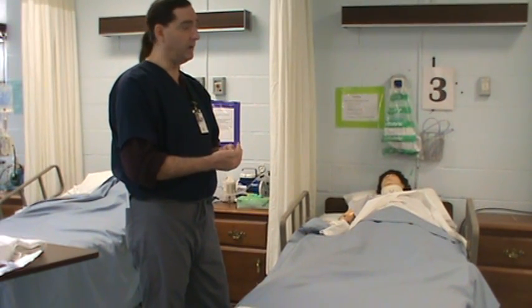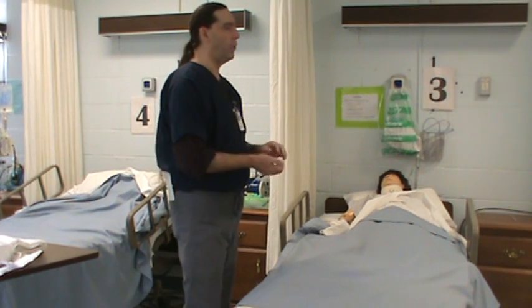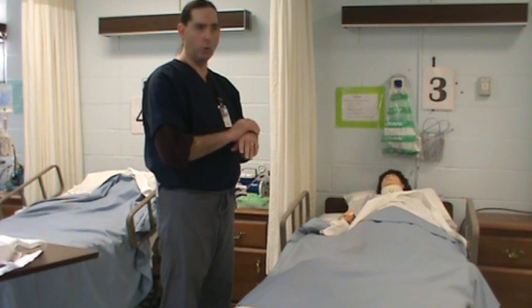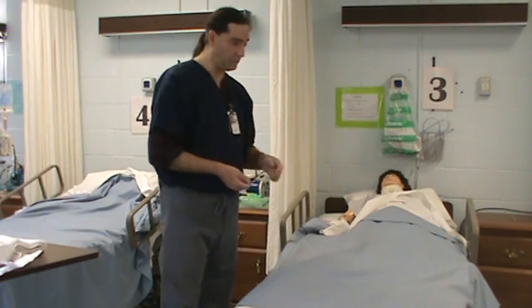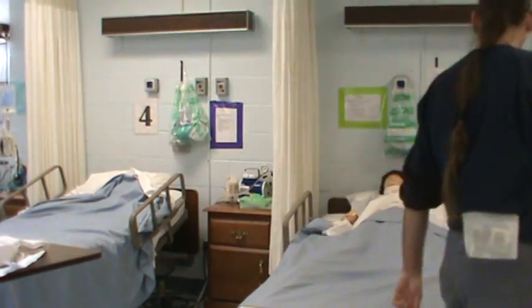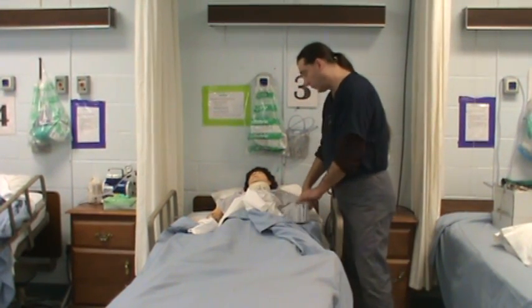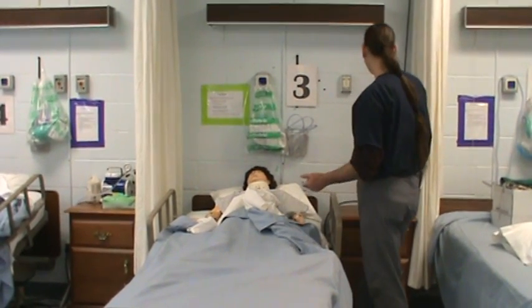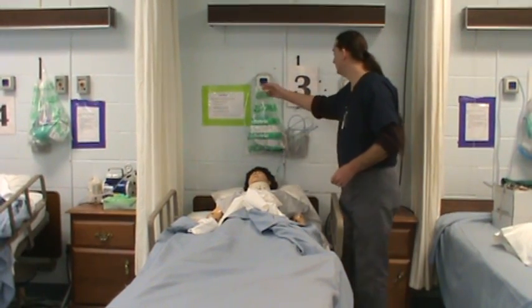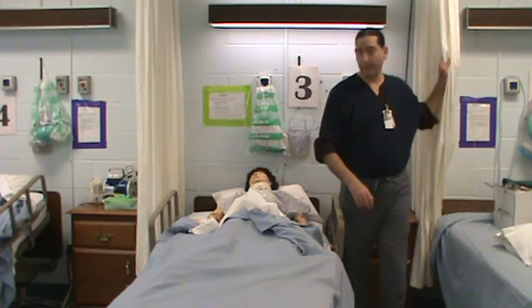I'm going to check my doctor's order to see that I have a Foley catheter order. Come to the patient's room. I'm going to do my hand sanitizer or wash my hands before I go in. I'm going to introduce myself to the patient: 'Hi, I'm Jim Adams, I'm your nurse and I'm here to place a Foley catheter. Doctor wrote for an order.' I'm going to check the wristband, make sure it's the right patient. I'm going to provide adequate lighting and provide for patient privacy.